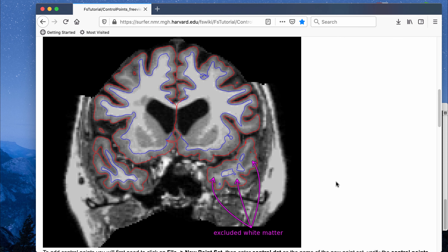Basically, when you run auto recon-all from FreeSurfer, it will automatically produce two boundaries for all your subjects. The red border is the pial boundary — it defines the boundary of the brain, and anything outside that line is non-brain tissue. It also produces a blue boundary, which is the white matter boundary.